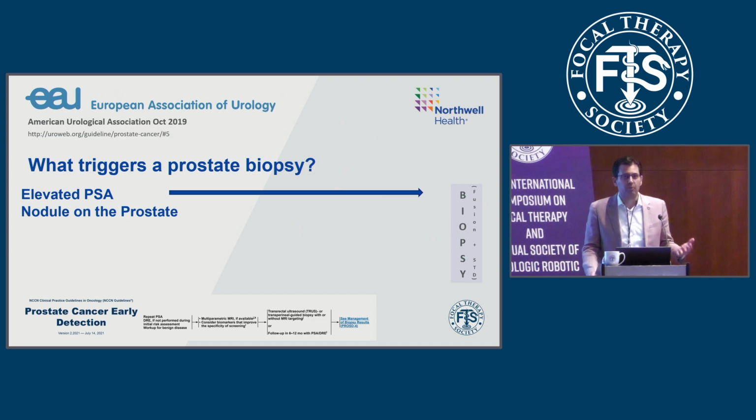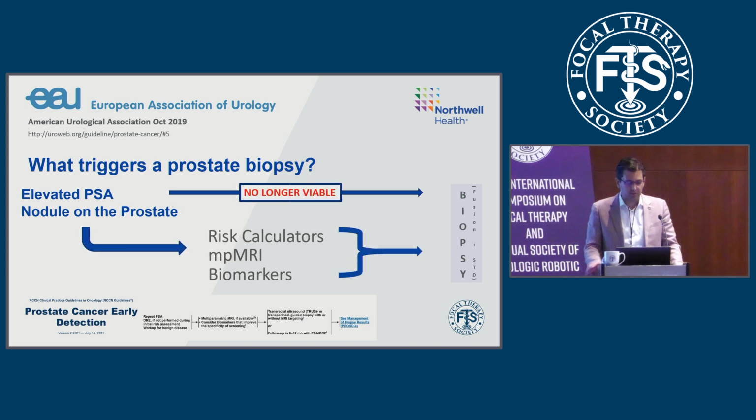I think at this point we all know that an MRI is one of the foundations in risk stratifying patients. No longer does an elevated PSA and a prostate nodule lead straight to biopsies, and this is in every guideline, pretty much in every major country around the world if it's available.